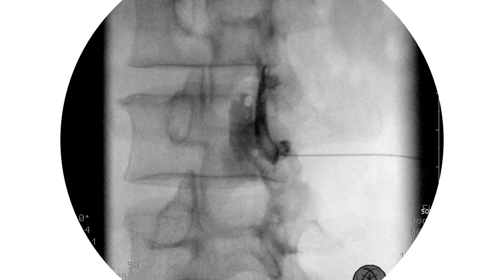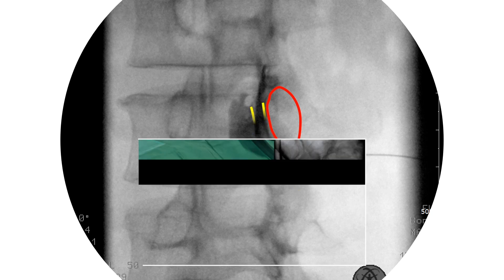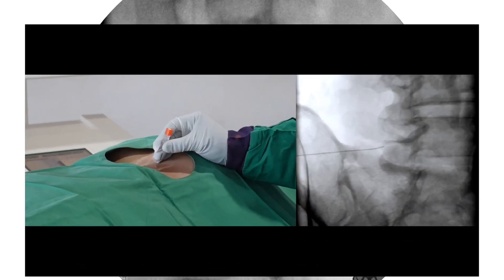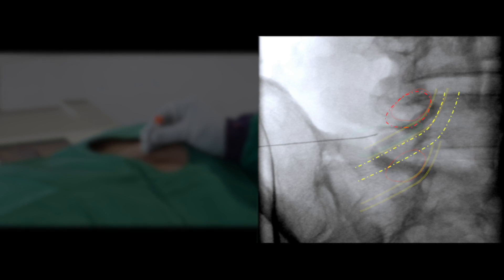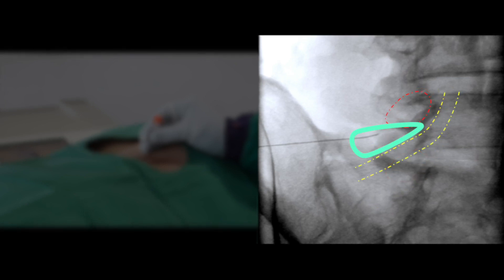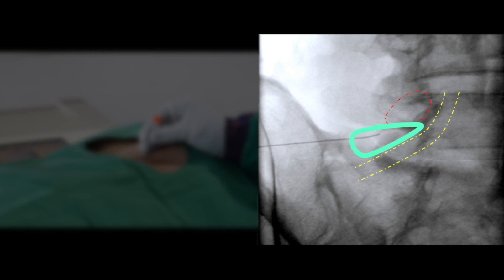Observe the L4 nerve root filling defects passing along the medial border of the pedicle. The nerve root will pass under the pedicle. This triangle looks like the safe triangle on AP view.